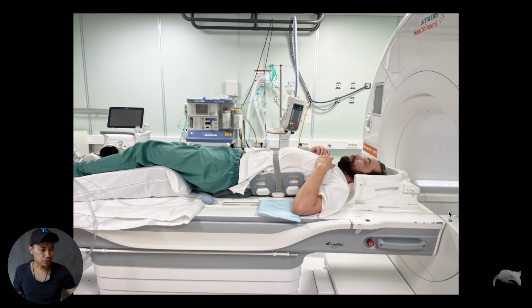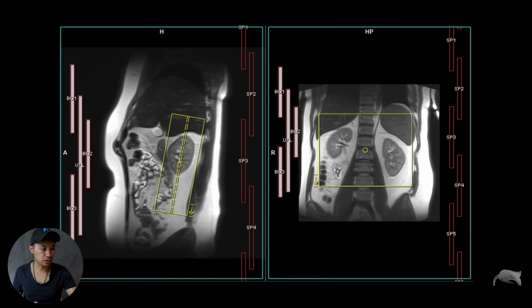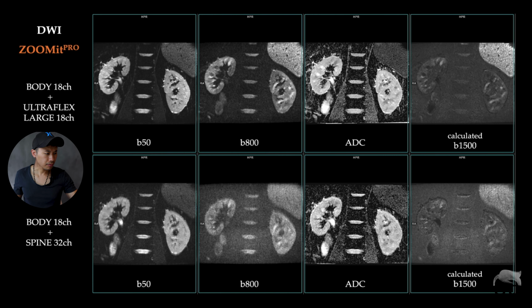And then I'm going to use one more coil on the top, this body 18. The coil setup for this thinking outside the box is that I'm using body 18 in combination with the Ultraflex large for the back. So the spine is not used at all. So the elements are like this. The spine elements are off, and then you have the body 18 in the front along with the Ultraflex in the back. So that combination will give you results like this.